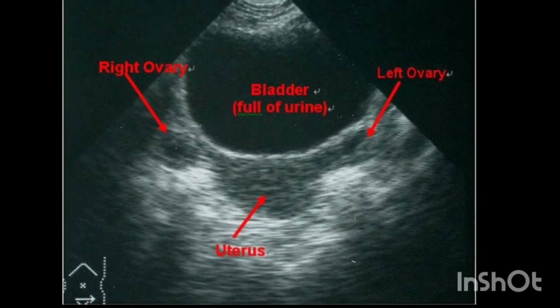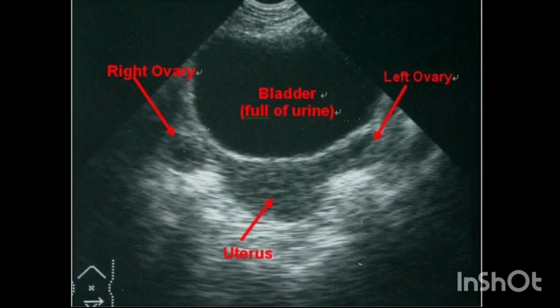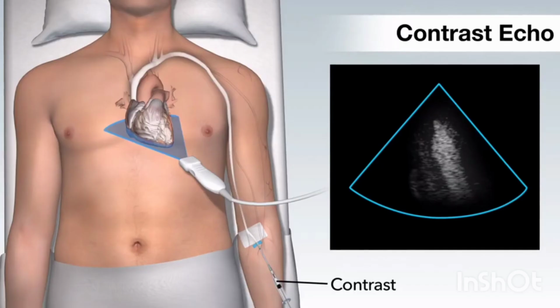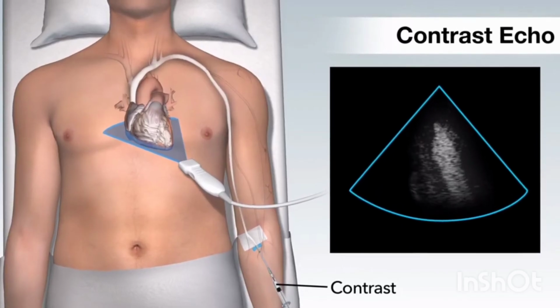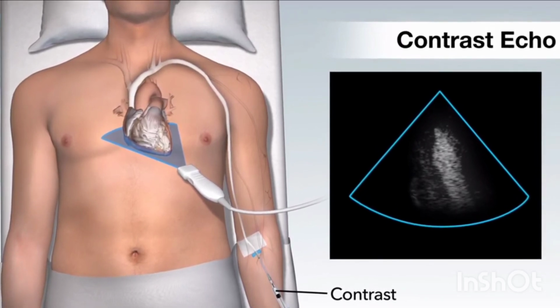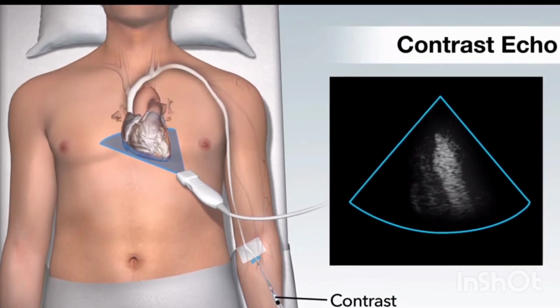Ultrasound is a non-invasive, immediate tool used to image tissue. It will not penetrate bone, like an X-ray. So the first step to help you read the ultrasound image is to be familiar with the anatomy that you are imaging. Various body tissues conduct sound differently. Some tissues absorb sound waves while others reflect them.